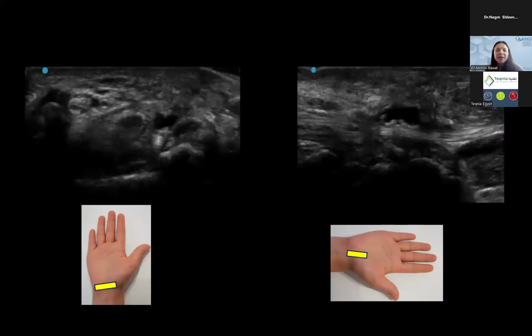So anything that extra sits there can be increased growth or swelling of the muscle tendon, which can be tenosynovitis, or an extra muscle belly sitting there, or this ganglion cyst. It's putting pressure, it's increasing the volume of the carpal tunnel. When there is increase in volume of the carpal tunnel, nerve is the most pressure sensitive structure, right?